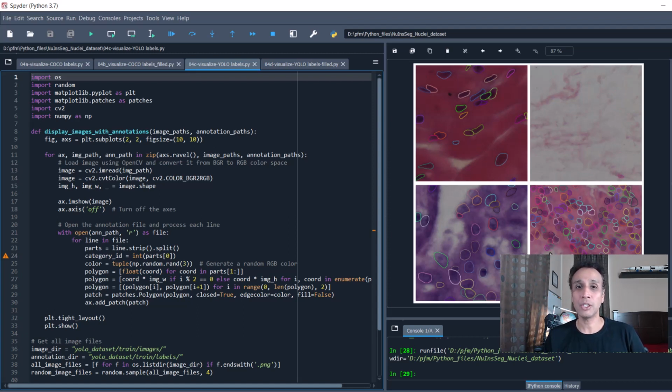So training a generalized model can be a challenge if you have this type of variability. So a good trick is to apply normalization, stain normalization. That is the video. Go ahead and check. If I remember, while uploading the video, I'll try to put this top tag thingy. I forgot what it's called, but please check for that video.